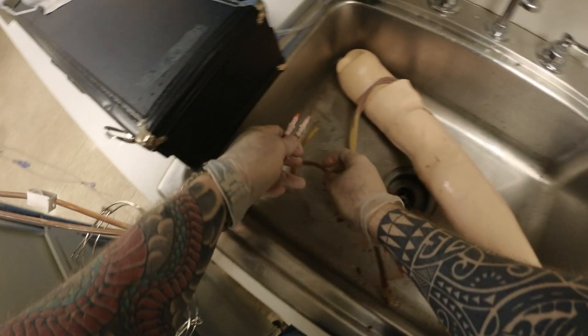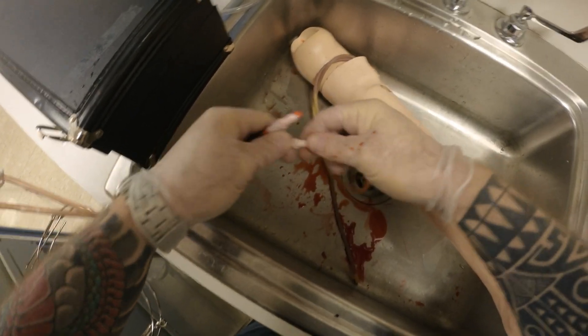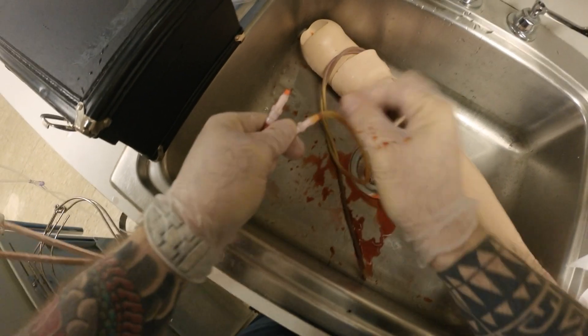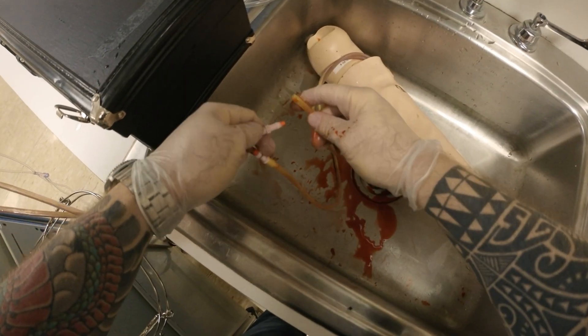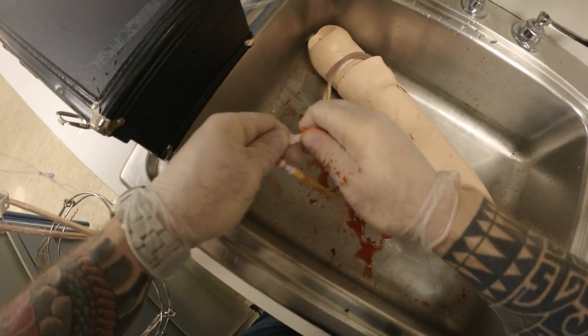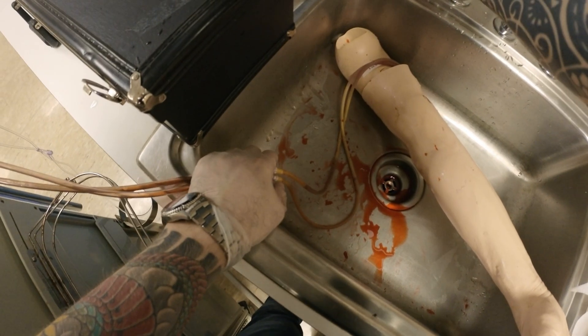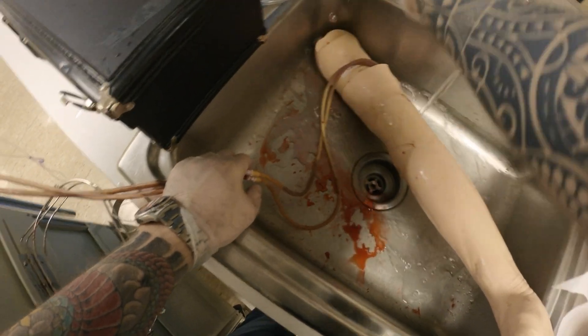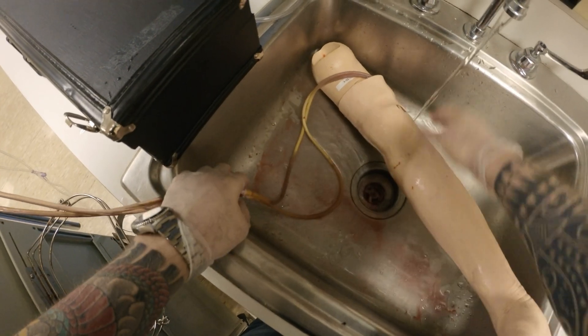The next thing I'm going to do is reconnect both of these to my arm, because now I've got to flush the system. I don't want any deposition of anything that will congeal or essentially clot. So I connect them, and what you want to run is warm water.